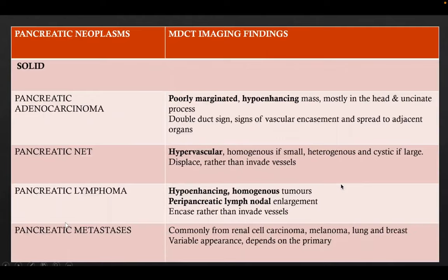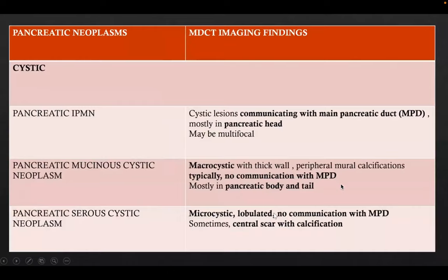Pancreatic metastasis is common from renal cell carcinoma, melanoma, lung, and breast, and shows variable appearances depending on the primary source. Pancreatic IPMN shows cystic lesions communicating with the main pancreatic duct, mostly in the pancreatic head, and may be multifocal. Mucinous cystic neoplasm is macrocystic with thick walls and peripheral mural calcification, with no communication with the main pancreatic duct, mostly in the pancreatic body and tail. Serous cystic neoplasm is microcystic, lobulated, not communicating with the MPD, and sometimes shows a central scar with calcifications.